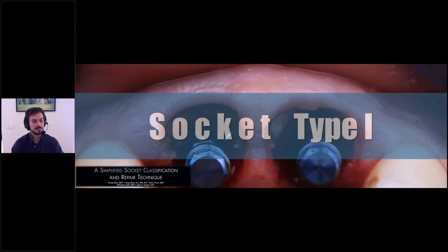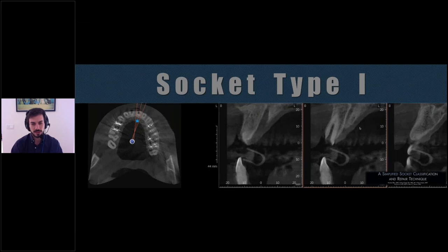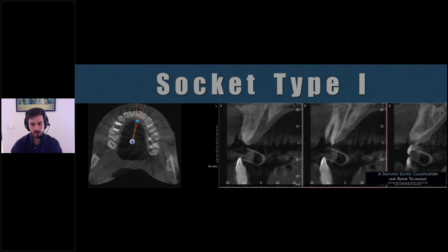A simplified socket classification and repair technique from Elian: we perform the socket shield technique on type 1 sockets of this classification. In sockets of this type, we have all the buccal bone in place, and we have no displacement of the soft tissues too.